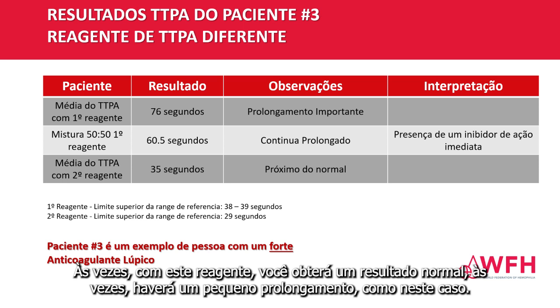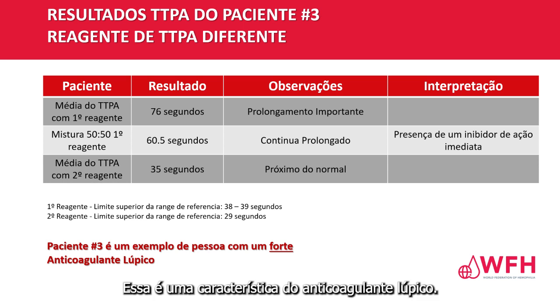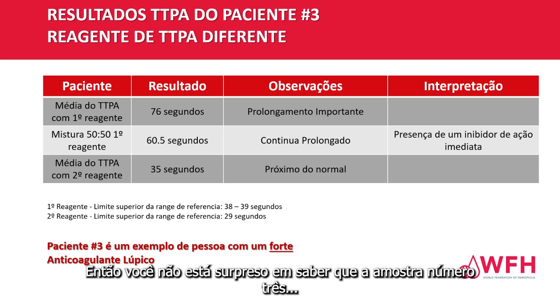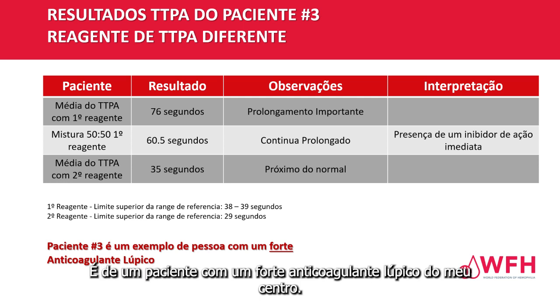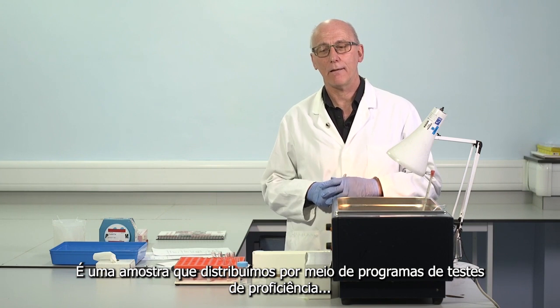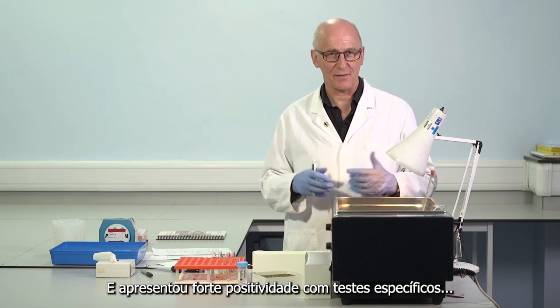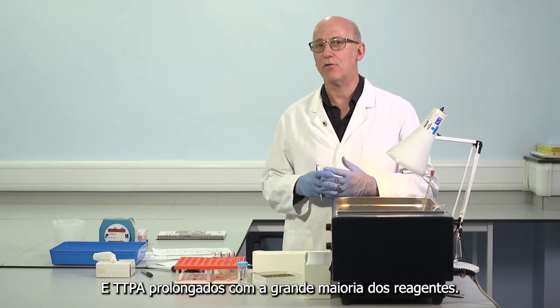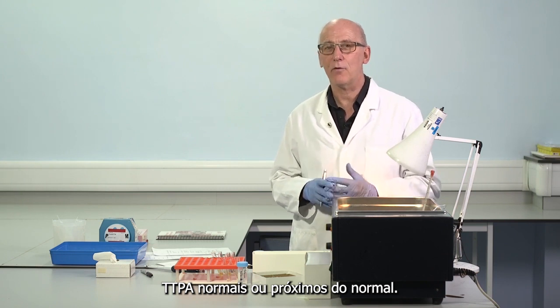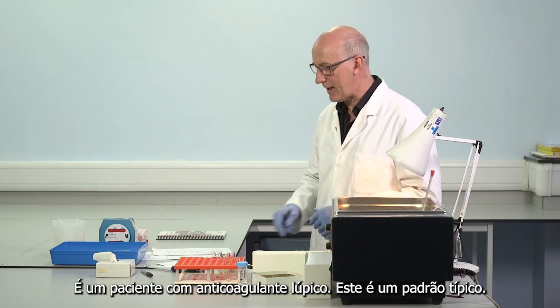Sometimes with this reagent you will get a normal result, sometimes there will be some mild prolongation as there is in this case, but you can see a marked difference. 75, 35, big difference. That's a feature of lupus anticoagulant. So you're not surprised to hear that sample number 3 is from a patient with quite a strong lupus anticoagulant from my centre. It's a sample that we distributed through proficiency testing programs and showed a strong positivity with the specific tests and prolonged APTTs with the vast majority of reagents. Normal APTTs, or close to normal, only those few reagents with very high phospholipid. This is a patient with lupus anticoagulant. This is a typical pattern.